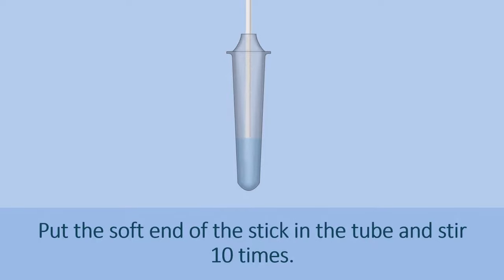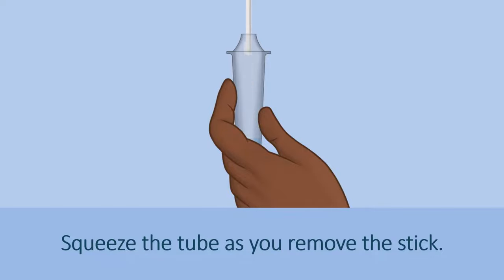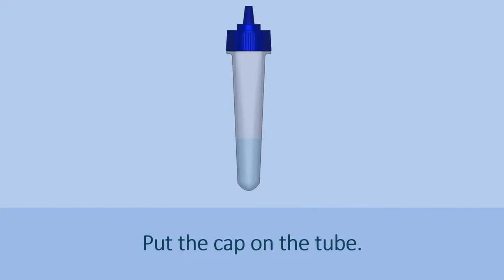Put the soft end of the stick in the tube and stir 10 times. Squeeze the tube as you remove the stick, then put the cap on the tube.